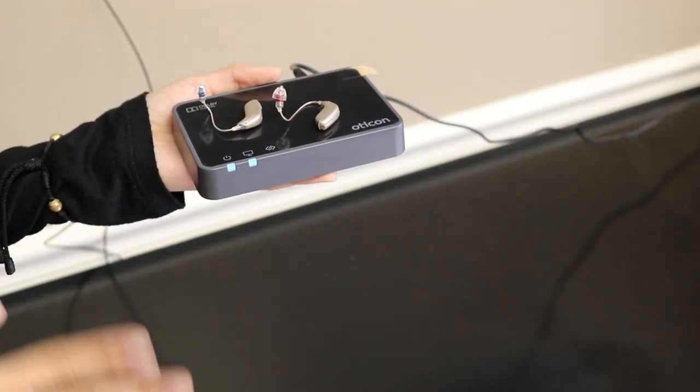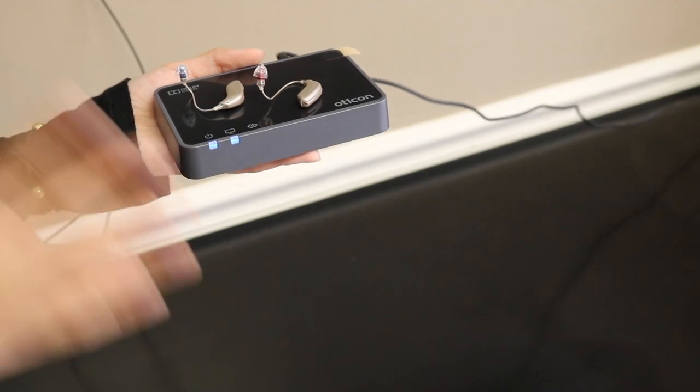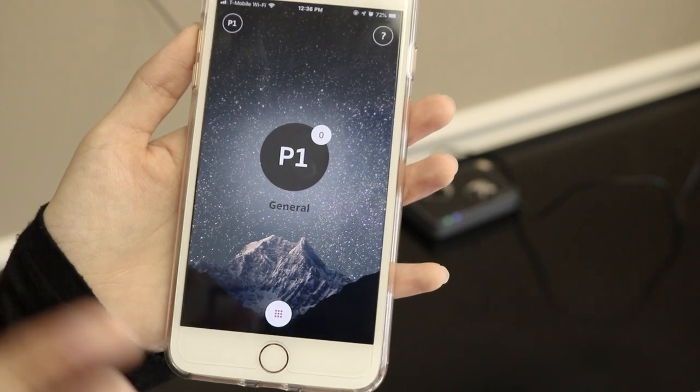As you can see here on the adapter, both lights are blue, which means that the whole setup process is complete. The last step now would be to go into your Oticon One app.